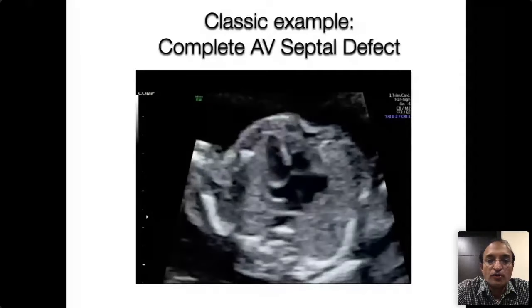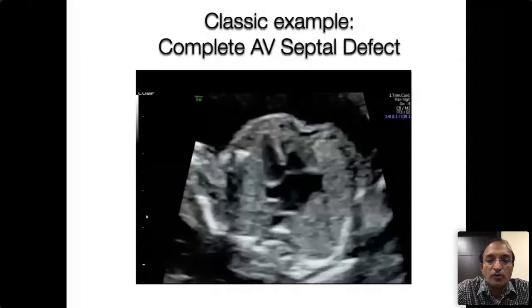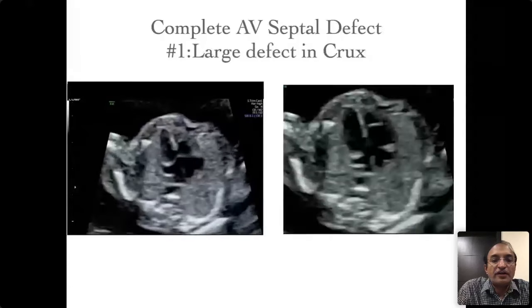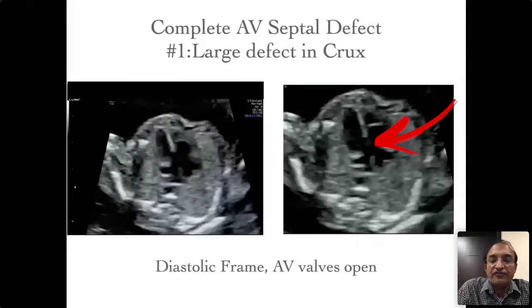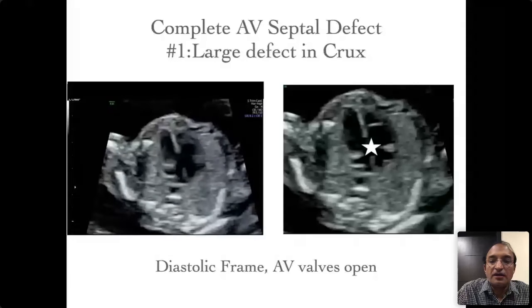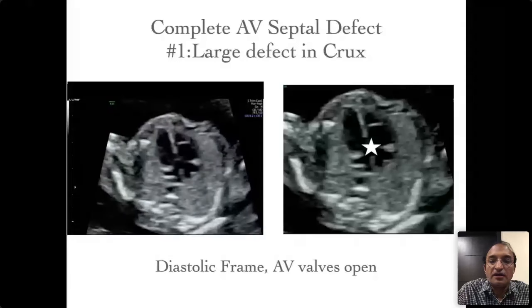The first component of the complete AV septal defect is a large defect in the crux of the heart. In a diastolic frame where the valves are open, you see a large defect in the crux of the heart. It is as if the entire central portion of the heart has been punched out.